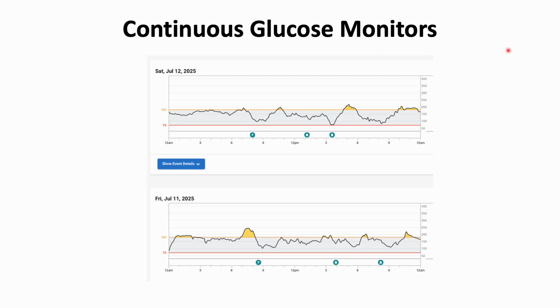And just one other depiction of CGM and the tracings that you can see for patients. These are individual days where you can see where their CGM readings were going for the day. So they're a little bit higher overnight here.